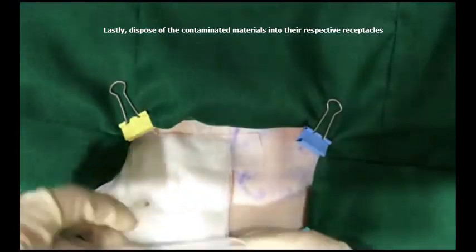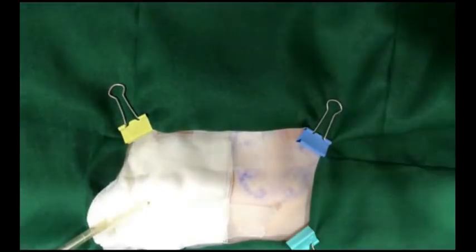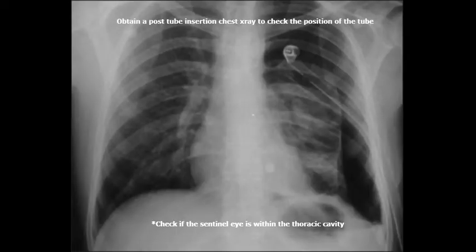Lastly, dispose of the contaminated materials into their respective receptacles. Obtain a post-tube insertion chest X-ray to check the position of the tube.